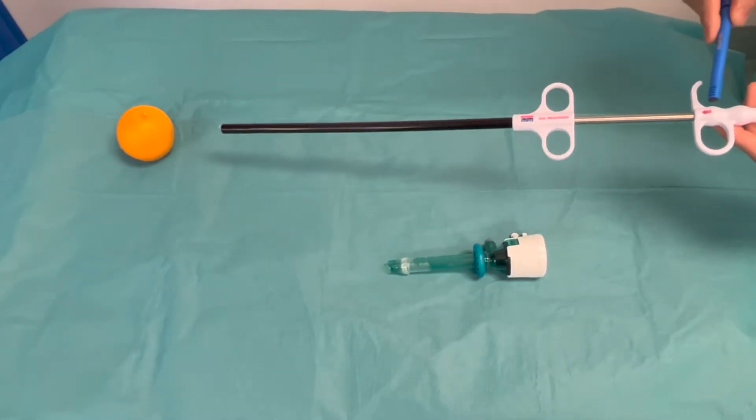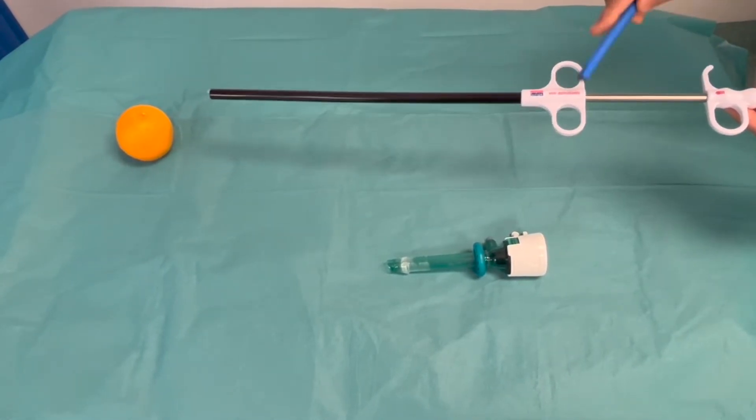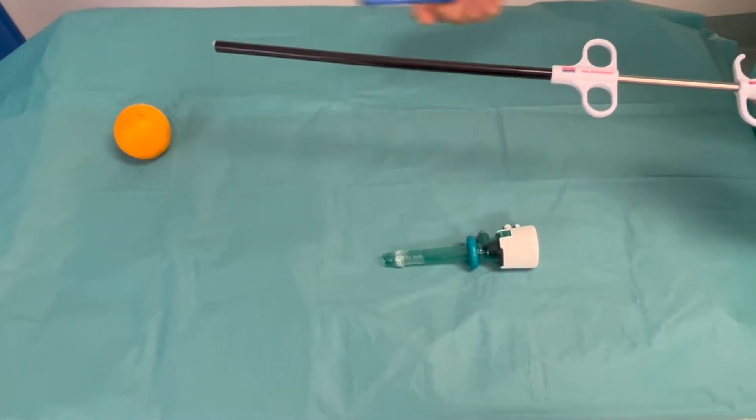This is the endobag, which has a ring for the thumb and two rings for the other fingers. The black is the outer sheet.